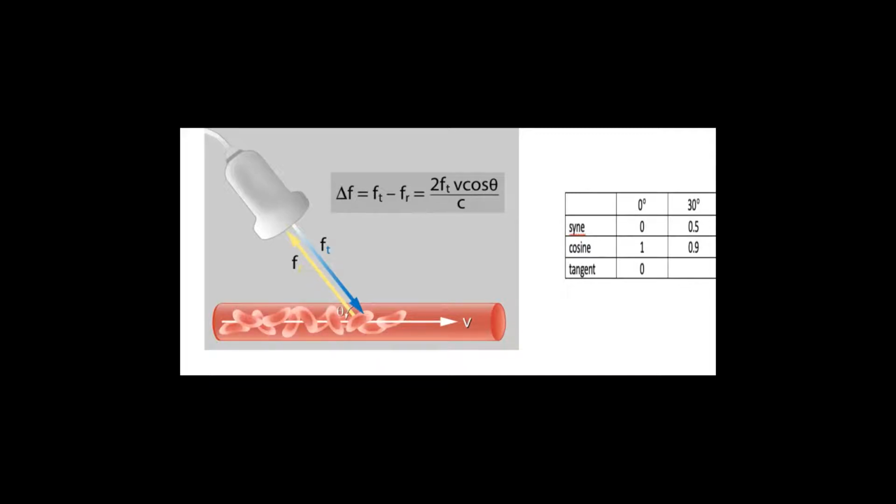Okay, that's why in the study of aortic stenosis, you can turn the patient to his right side and use the non-imaging probe, and you come from the right parasternal, you come from the suprasternal, you come from the apical window, a multiple window scan. Okay, trying to find it by chance, because you can't know for sure, so you have to do it by trial and error.